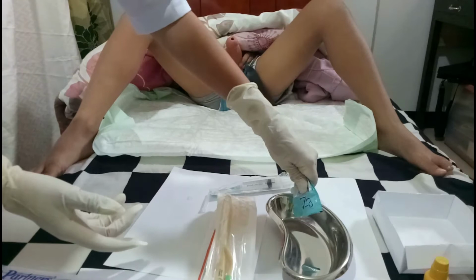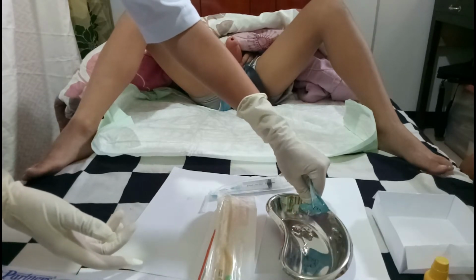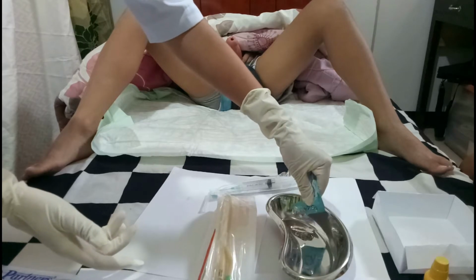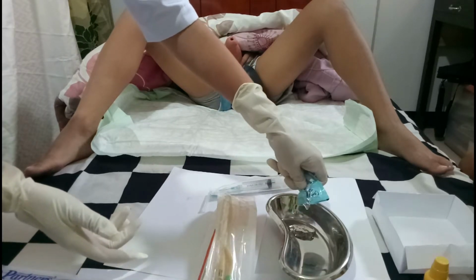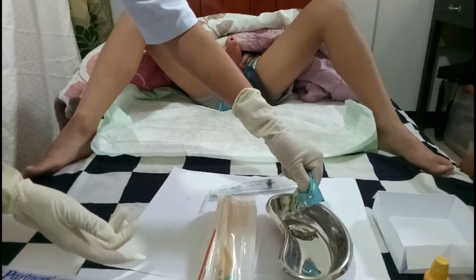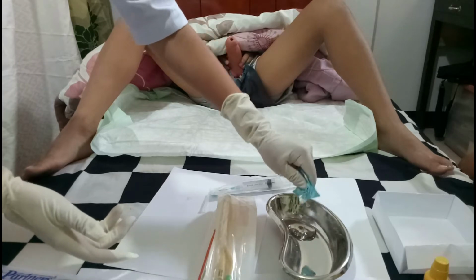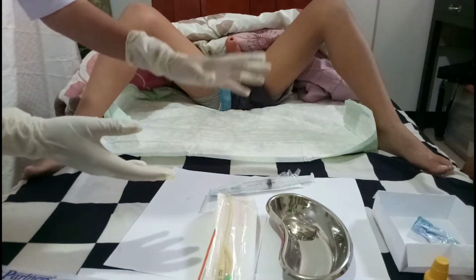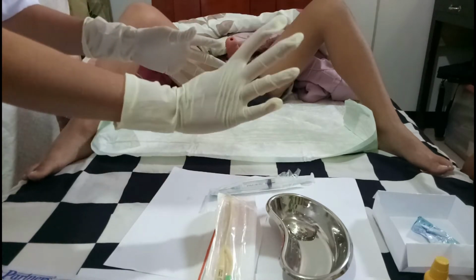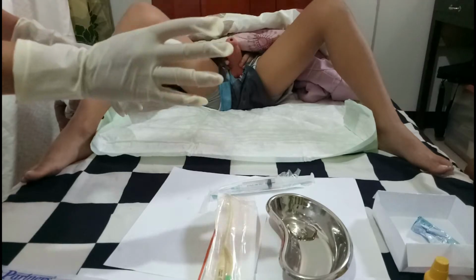Then, I will put it on the kidney basin. So, I'm using my non-dominant hand. And discard. So, this is now not sterile while this dominant hand of mine is still sterile.